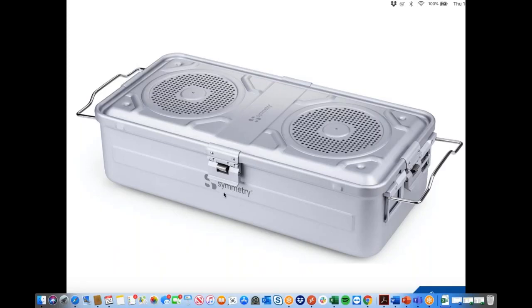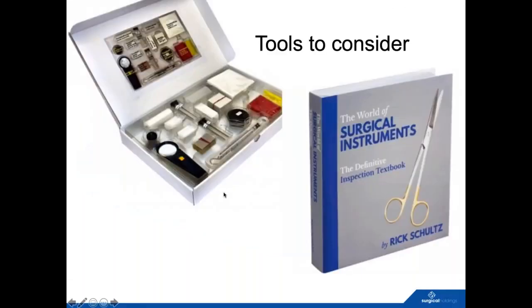Yeah, totally. Okay, so finally, just to sum up some tools to consider. Inspection kit, which I think is quite interesting, that's available through Germany, which is based on the DIN standards. So you've got your red and yellow test materials there, and some other testing matter, things that are useful for things like osteotomes, chisels. So that's something to consider.